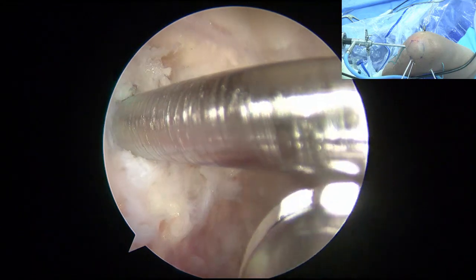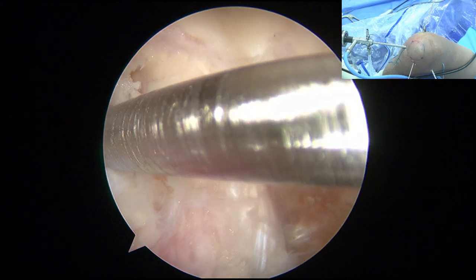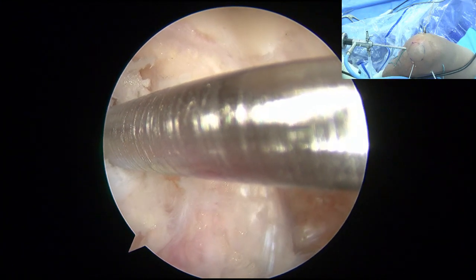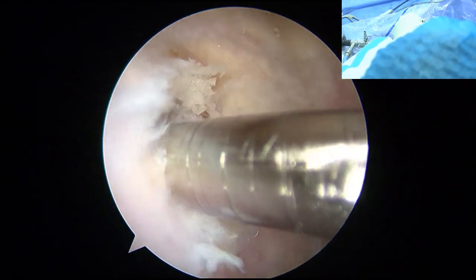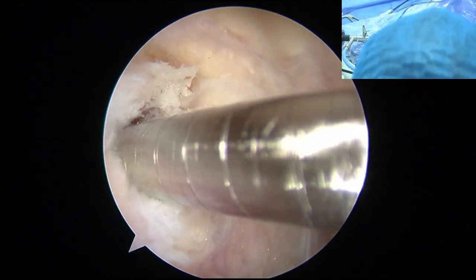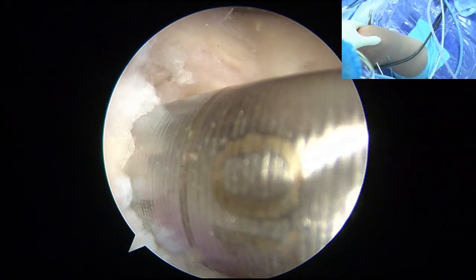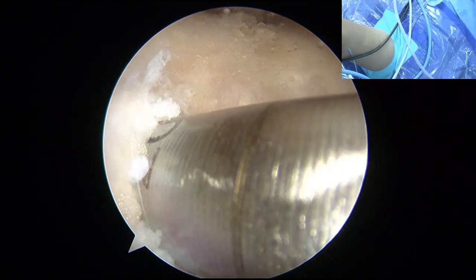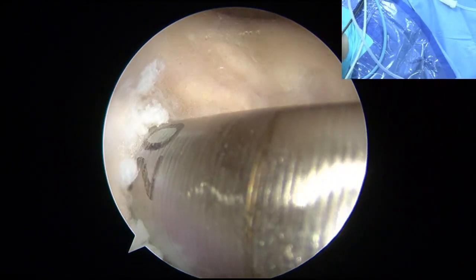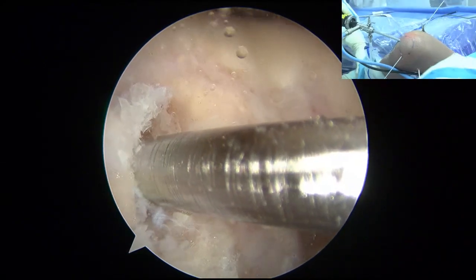So now you finish. You see that we don't need to go through the center. We separate our posterior and anterior. Okay, so that's easier. 这样两个隧道的制作呢是分开的, because looking from the front using the nipple. Easy for now. 20, okay, good. 20. Good, and good the suture.